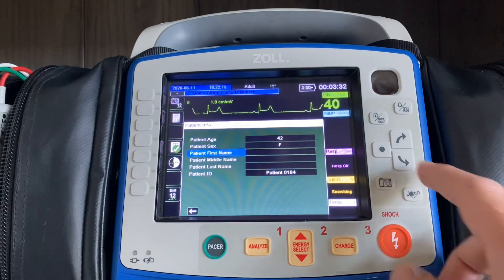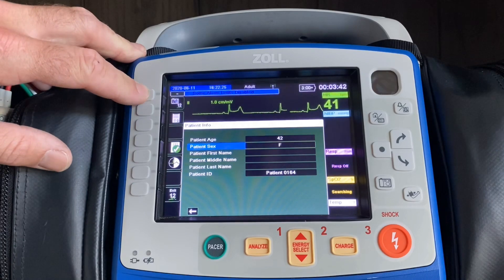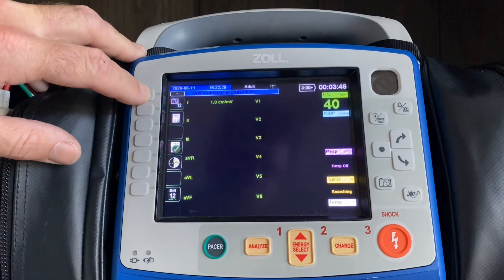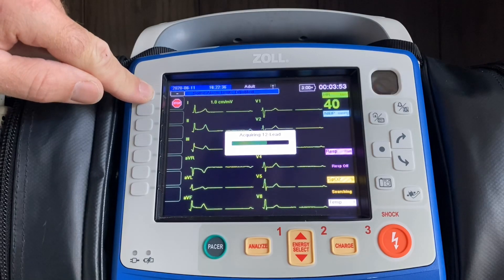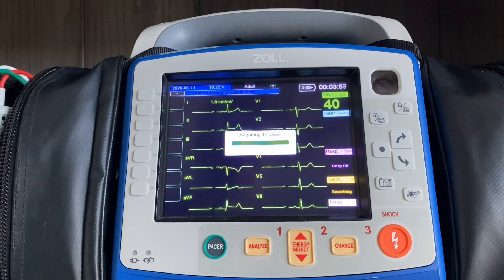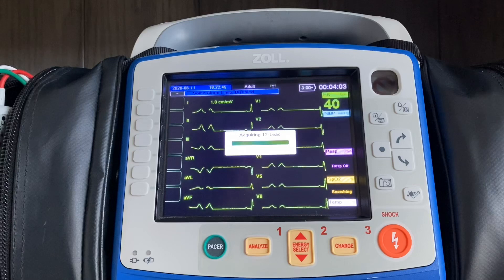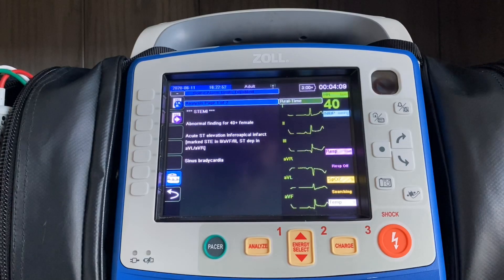Once that information has been entered, you do not have to scroll all the way down — we see a lot of people end up doing that. Once you have the age and gender entered, get the patient to sit still. You're going to take a picture of their heart by hitting the camera with the 12, and it'll start to acquire. For five seconds, you'll have the option to stop that acquisition. So if you look at the screen and you see what you know is going to be a bad 12-lead printing out, you can stop that acquisition, get the patient to settle down, readjust electrodes, whatever you need to do until the tracing on the screen is clear, and then hit the camera with the 12 again and it'll acquire automatically.